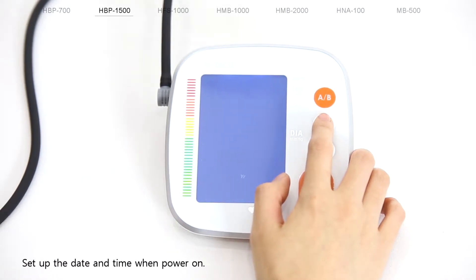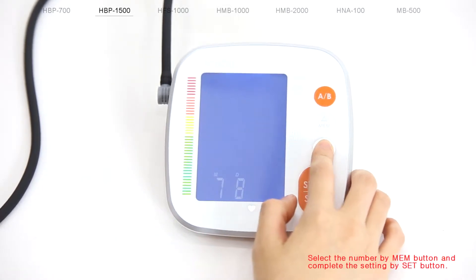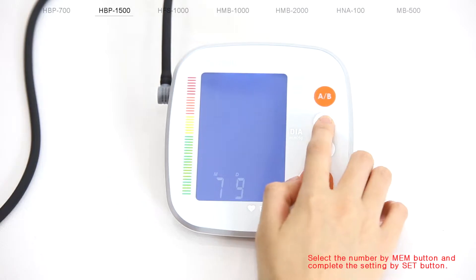Set up the date and time when powering on. Select the number by the MEM button and complete the setting by the SET button.